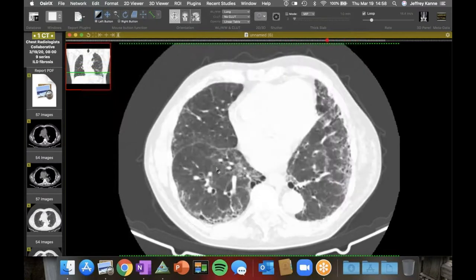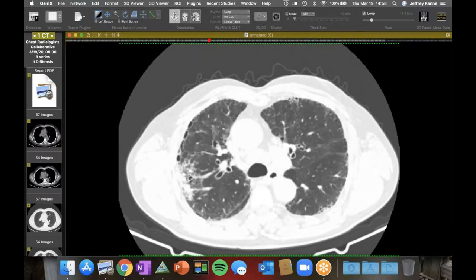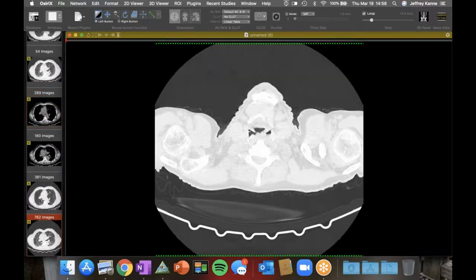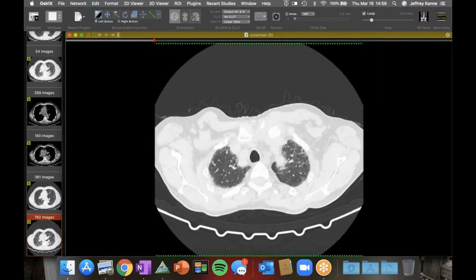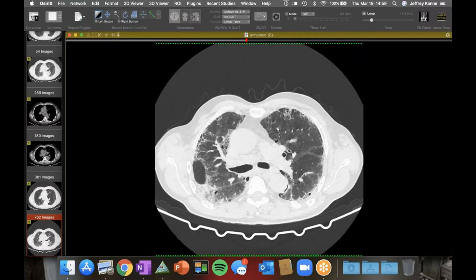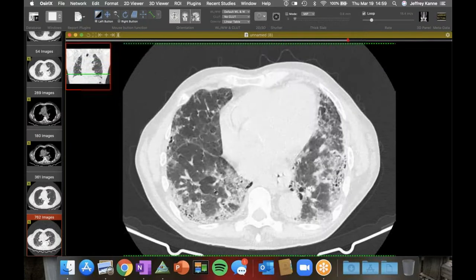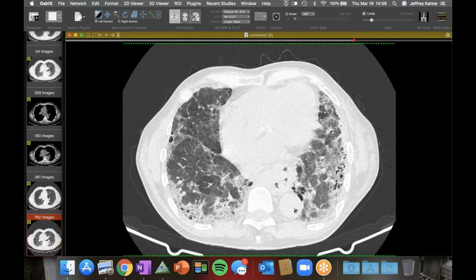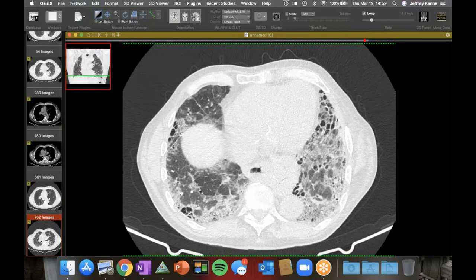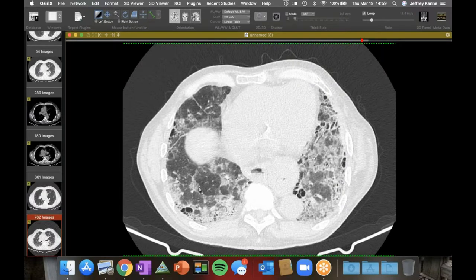But he also has a mass, and it's up here, and this one's a little more challenging. You can see it's solid, so it should raise some question. But it's a little more amorphous than that last one. On subsequent imaging as well, I think this is the right series, it is also larger, more confluent there. But interestingly, the patient developed a lot of this denser stuff in the lung bases. You can see there's very dense ground glass opacity, almost consolidation. We might think about an acute exacerbation, but he was ruled out clinically for that.